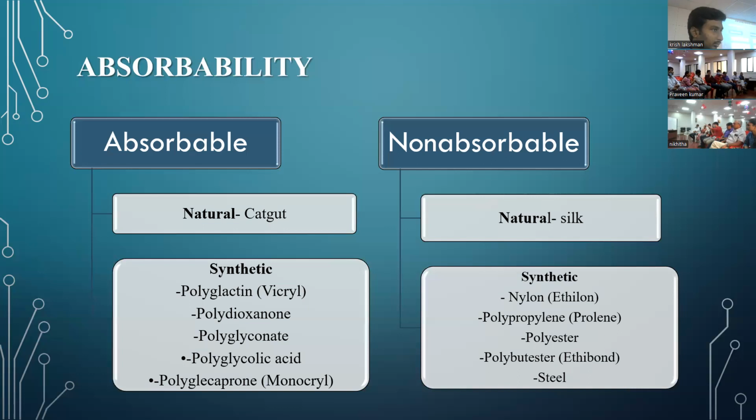Second point. When does the suture get absorbed? Just ask me in general. Have you heard of any suture getting absorbed within 7 days? Yeah. So what happens if you leave a suture or a foreign body in place for a long period of time? Scarring is more. That is why, for cosmesis on external surfaces, it is always better to use non-absorbable suture, because you can take out the suture at the earliest and allow the wound to heal.